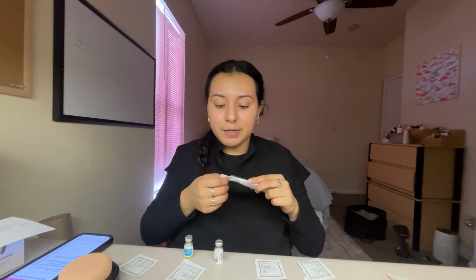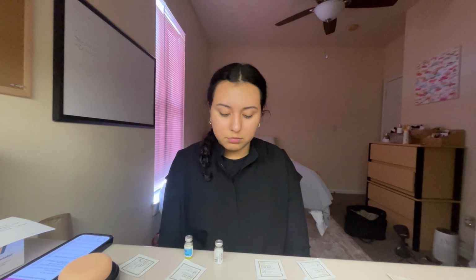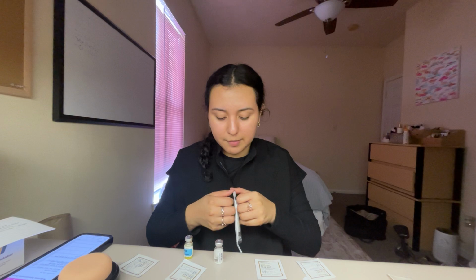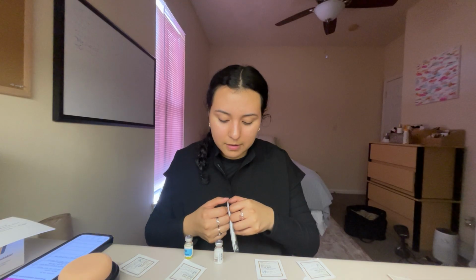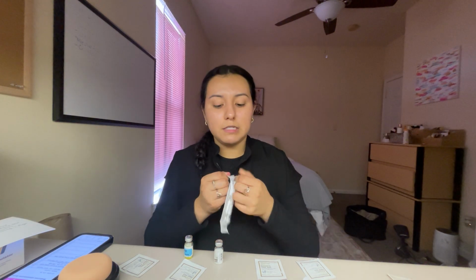Okay, so now I'm going to prepare my syringe with my needle. I'm going to prepare my syringe with my needle, and this is what I'm going to use to draw up my medication. So let's see.